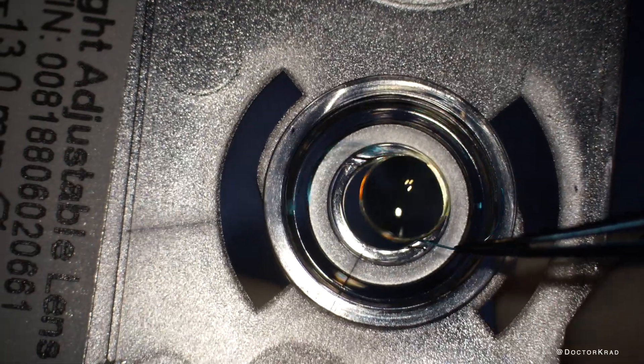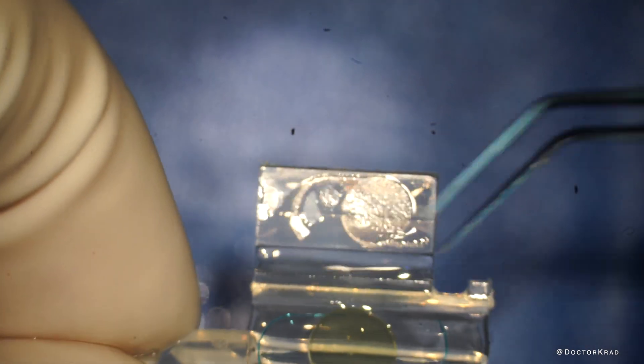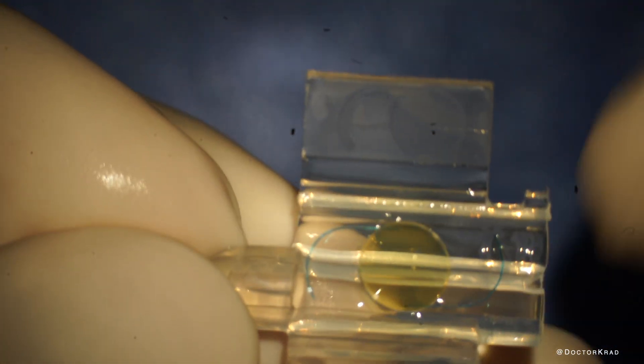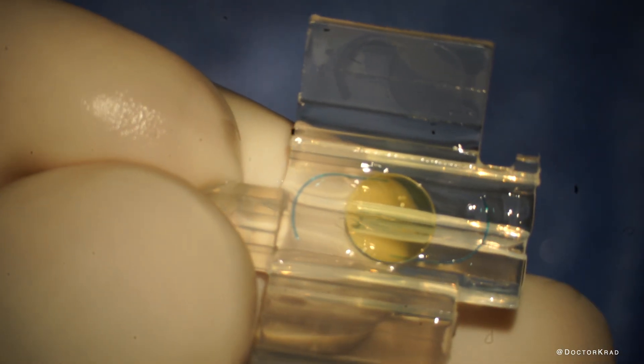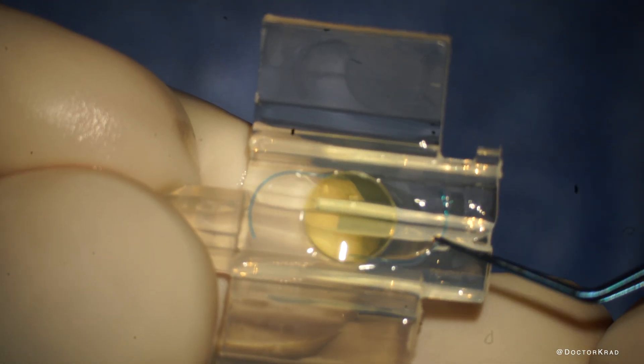Then you grab the light adjustable lens by its haptic and you gently lay it down on the cartridge. You want to make sure it's oriented just like the image of the IOL on the flap of the cartridge. And you want to make sure that the lens is seated forward. Let the leading haptic touch the nozzle all the way forward to the left.